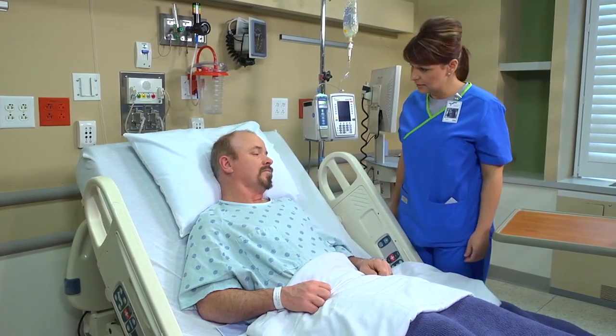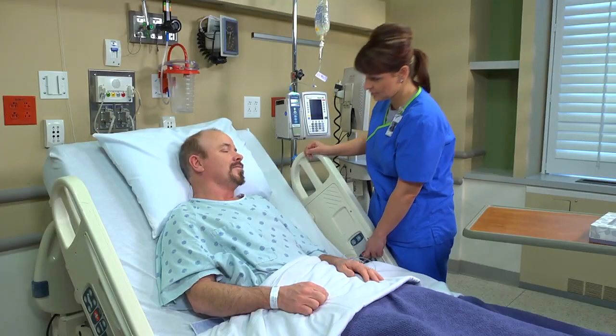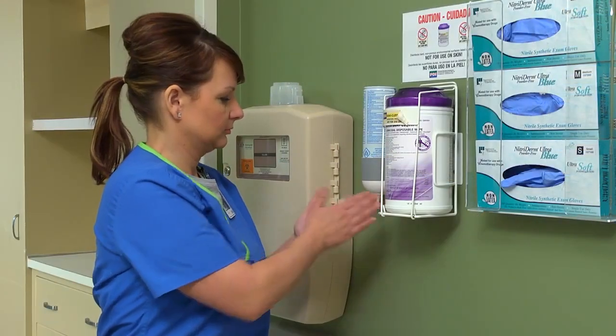Can I get you anything else right now? No? Okay. Instruct the patient to avoid raising his arm, since doing so may affect the flow rate, and caution him against touching the control clamp. Perform hand hygiene.